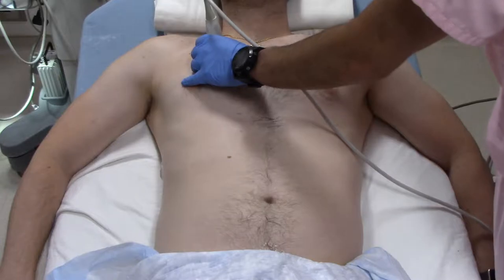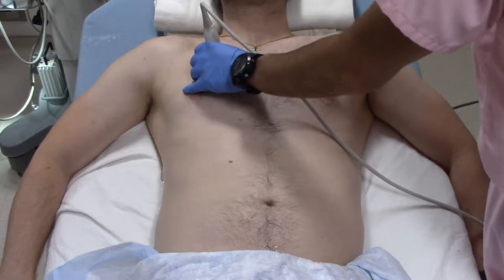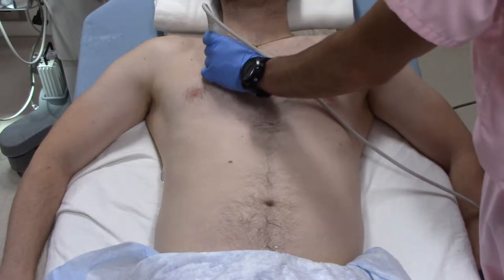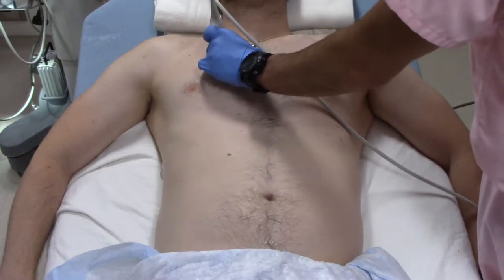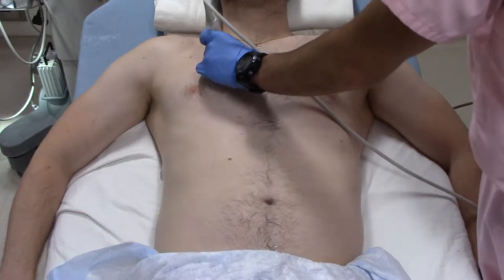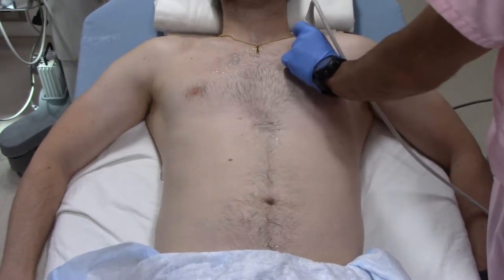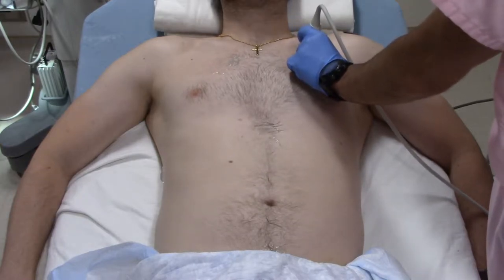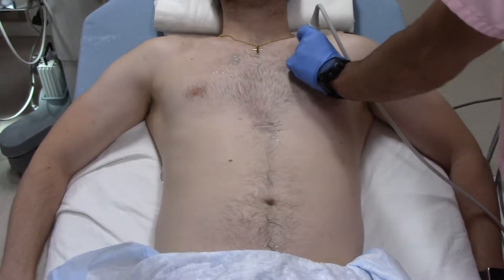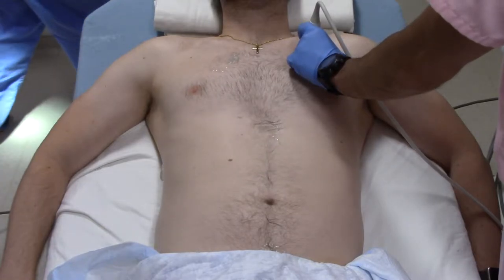So if the patient is intubated, they need to be bagged or you wait for a breath to trigger on the vent. You need to see the rib, so your transducer cannot be horizontal in between rib spaces — you need to be vertical across the intercostal space, usually about second or third, midclavicular line. Go from right lung, erase the label, and go over to the left side. Anytime you're not sure if you see lung sliding, compare it to the other side — that's usually the best way to tell, especially for COPD patients or those with deep chests.